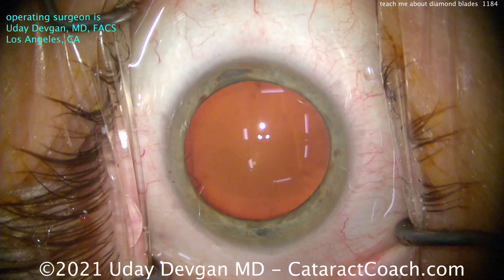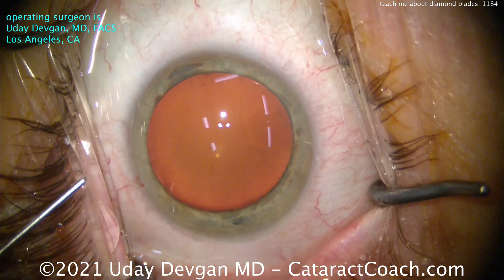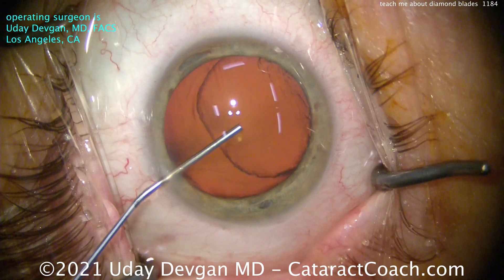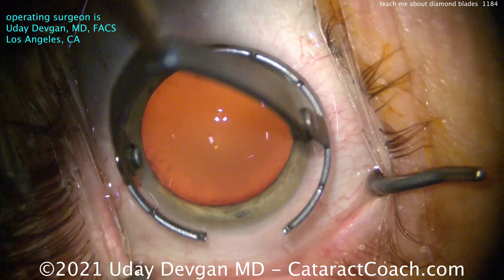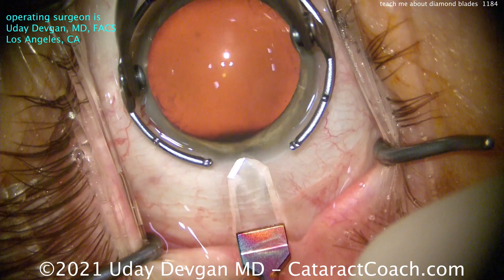A diamond keratome is many times sharper than a steel keratome. The steel blades are just good, but the diamond keratomes are much better. Because they're so much sharper, the incision that they make is much cleaner. It seals better and heals faster.